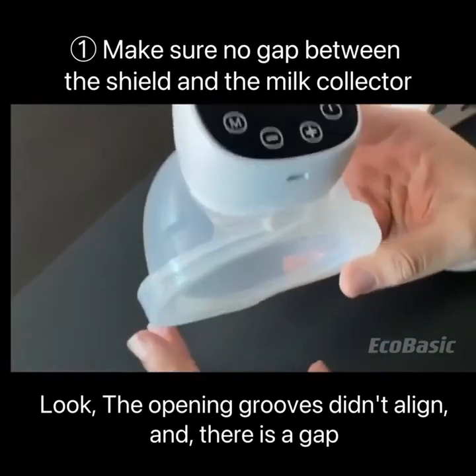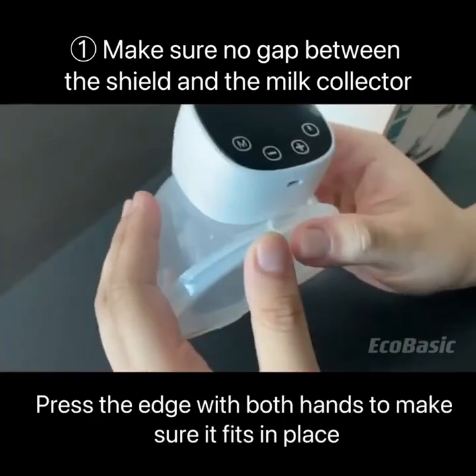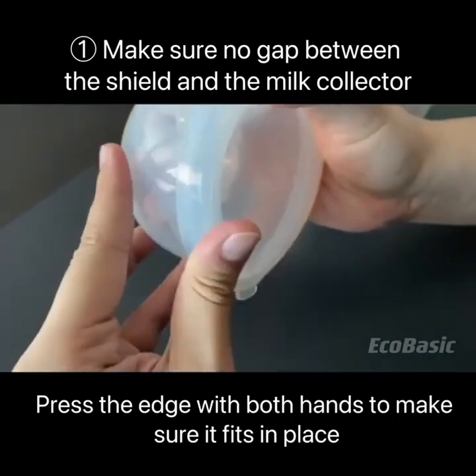Look — the opening grooves didn't align, and there is a gap. Press the edge with both hands to make sure it fits in place.